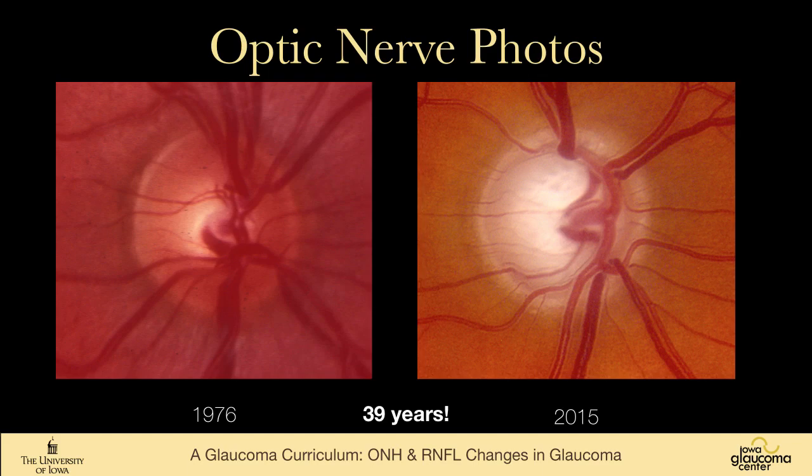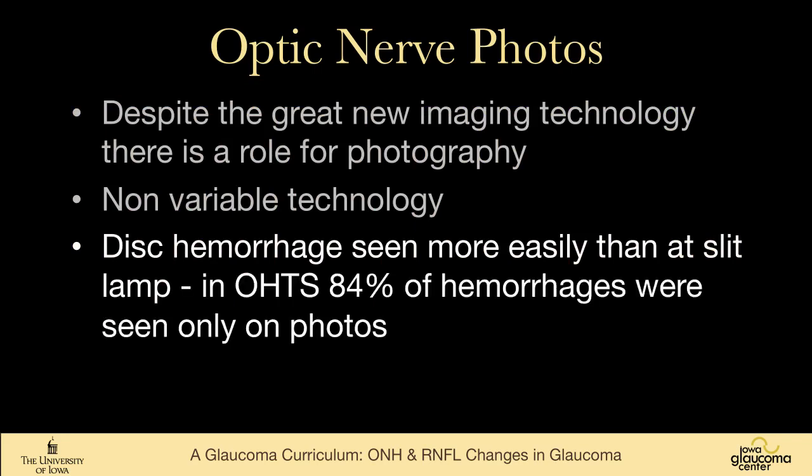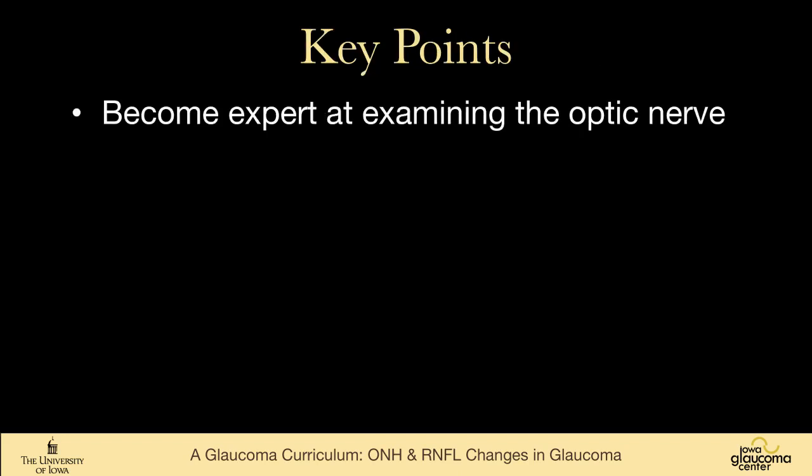And so I would encourage you to continue to get optic nerve head photographs. Remember, disc hemorrhages are much more easily seen on photos than at the slit lamp. In OHTS, 84% of hemorrhages were seen only on photos. When in doubt, take a picture. You'll never regret taking a picture.